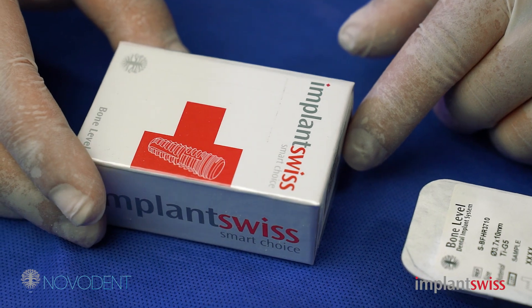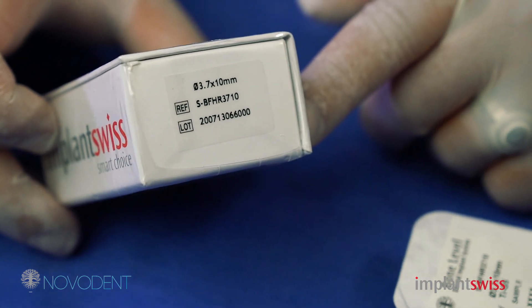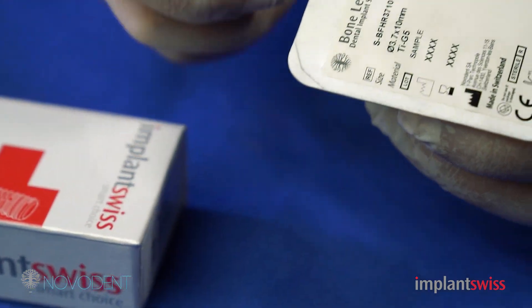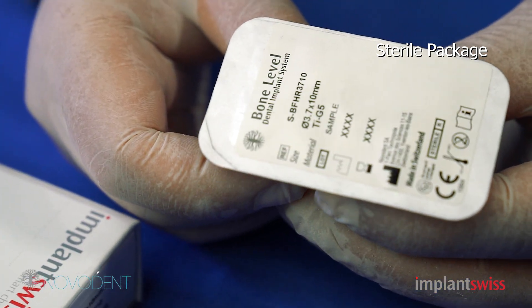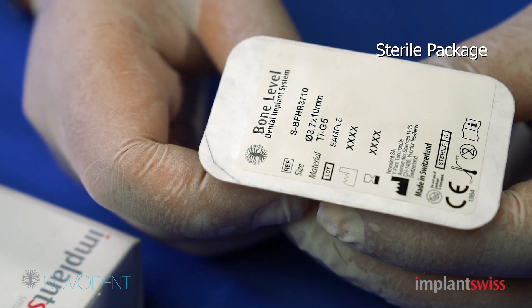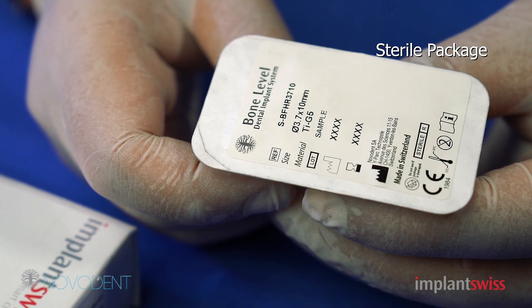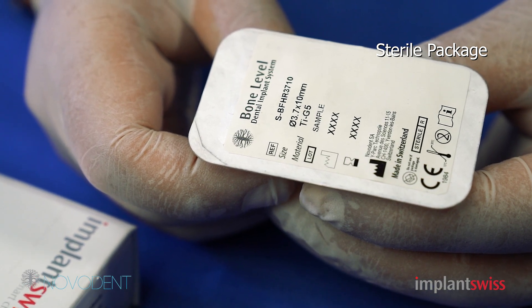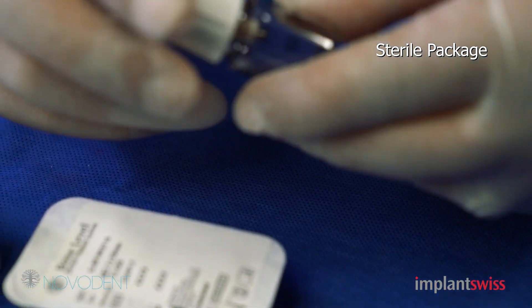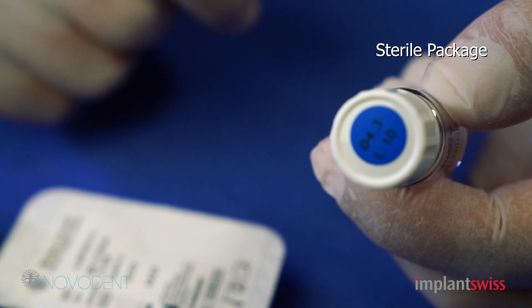This is the great package system of the Implant Swiss fixture. As you can see, all the information is on the outer package. Once you open the outer package, you go inside the inner or sterile package, which is disinfected and sterilized by gamma. All the information of the implants is there: the lot number, the size, the sterilization date, the expiry date, and the name of the manufacturer. Once you open the outer package, you go for the inner package, which is a very nice, clean glass vial containing the implant inside.